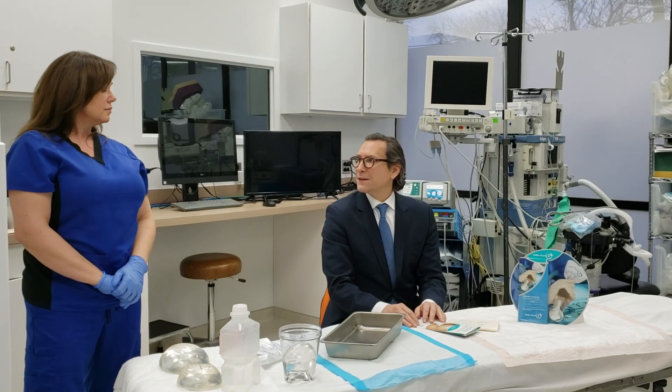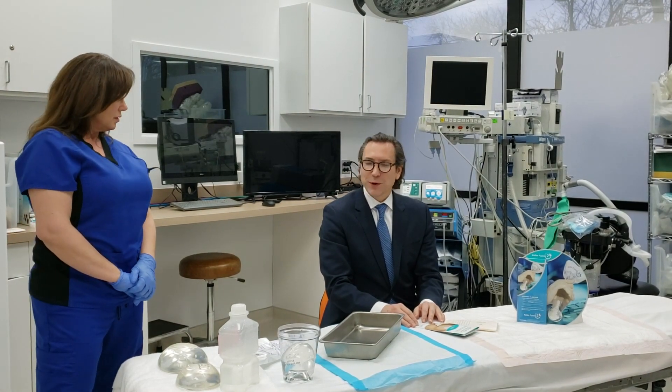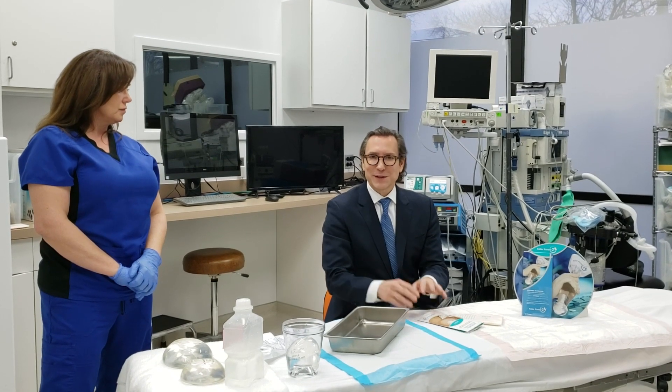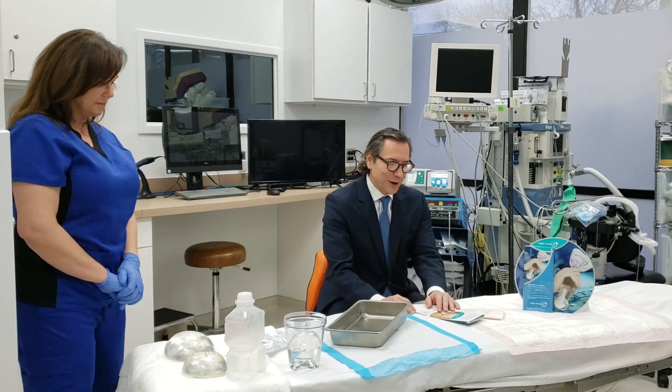Why don't we go ahead and at this point actually show you how we use the Keller Funnel — not in a patient, but actually just here on the operating room table.